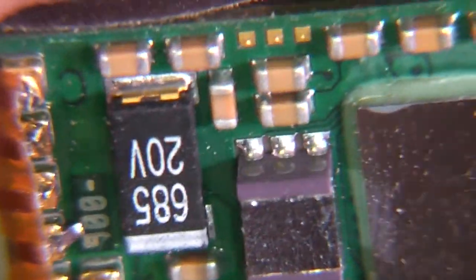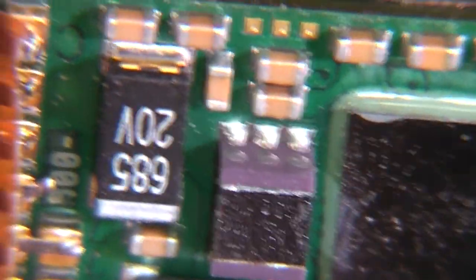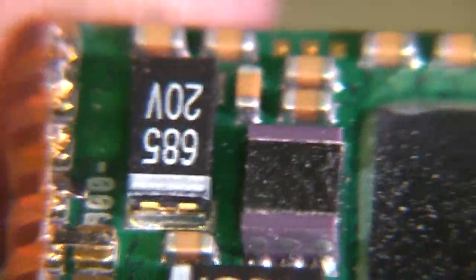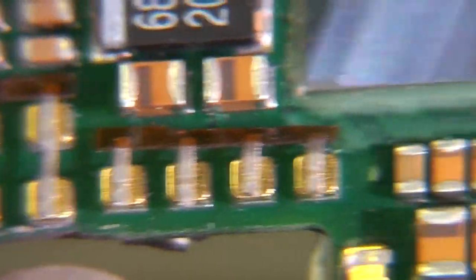I'm not quite sure what this is. I think it might perhaps be some sort of filter. If that sensor piece is ferrite, then maybe it's just some sort of common mode filter or something for RF interference. The rest of the parts, you've got obviously tantalum capacitors here, ceramic caps.